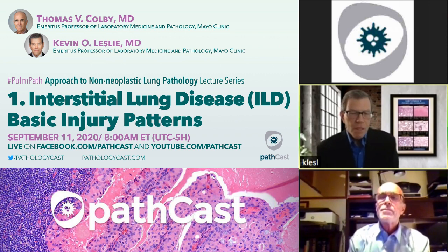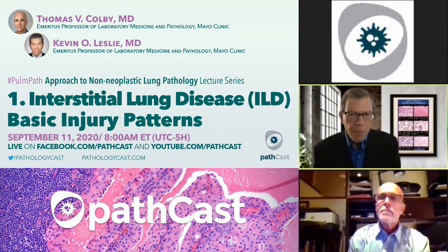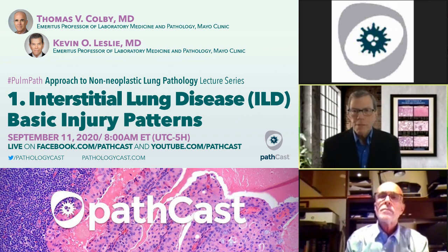Before COVID, every diffuse alveolar damage biopsy would come with a note from the pathologist saying, I'm very worried that this is lung disease on the basis of thromboembolism because I'm seeing thromboemboli in vessels, in fact, even some bone marrow emboli in vessels. These are very common in severe acute injury in the lung. Unfortunately, not very specific in my experience.